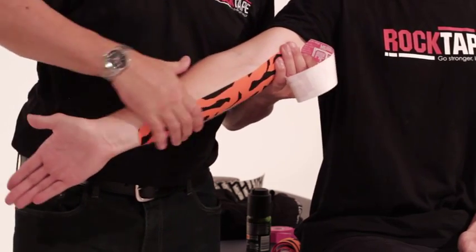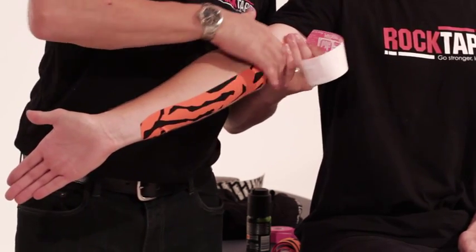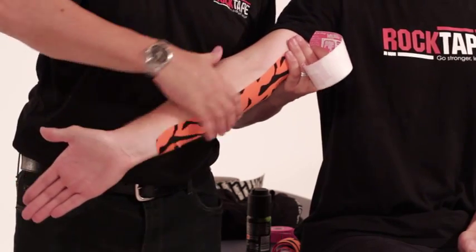Give it a good rub. The tape is heat activated, so by giving the tape a good rub it will allow it to stick a lot better to the skin.